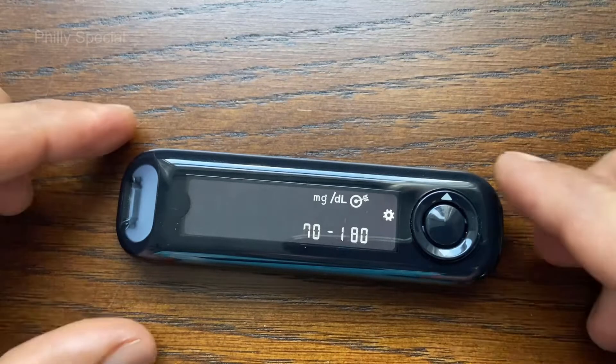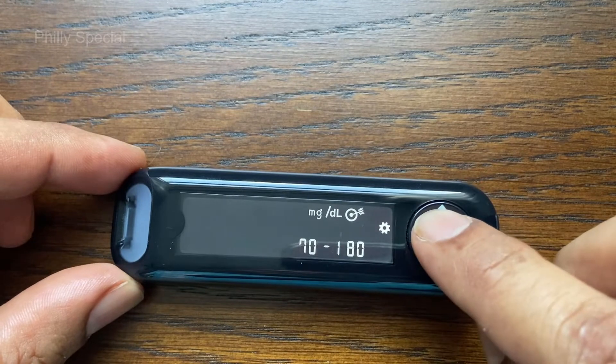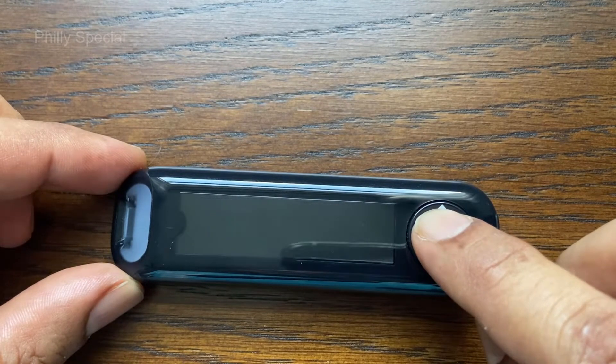In this video we will be replacing the battery from a Contour Next 1 blood glucose monitoring meter. When the batteries are low, the low battery symbol displays on the screen.